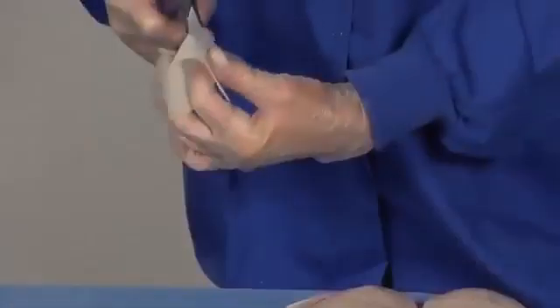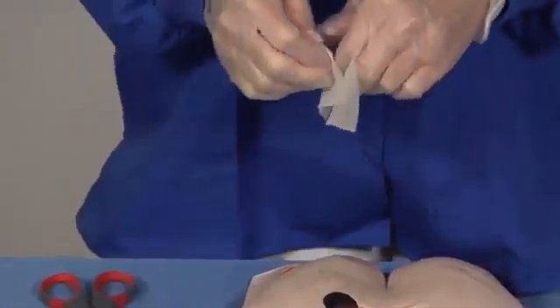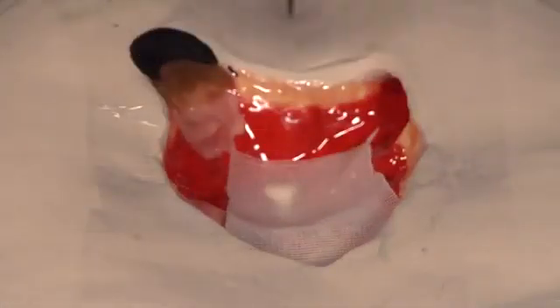Note, as an optional step when using foam, the clinician may choose to cut a piece of non-adherent dressing not included in the kit to fit any area over bone, tendon, and/or ligament, placing the foam into the wound bed.